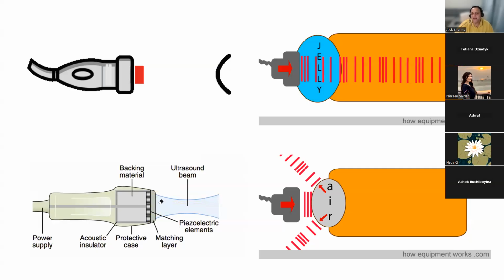I can't emphasize enough how knocks, drops, and simple things matter, like if you take your ultrasound machine and the probes are kept at the side, even the power supply cables, if they come under the wheels, they'll get damaged, they'll get crushed, there'll be drag. You'll end up damaging the acoustic insulator element, and then basically you don't get as good a generation.